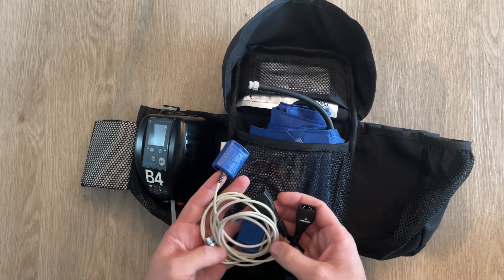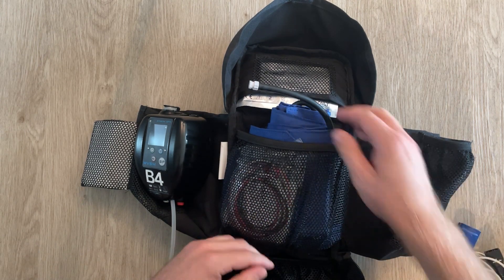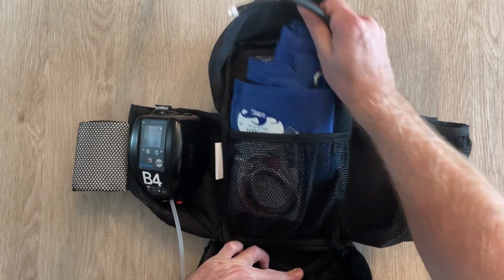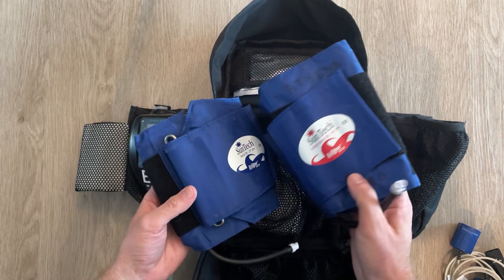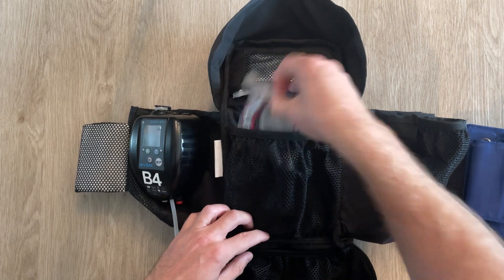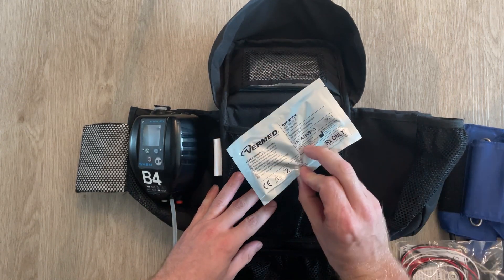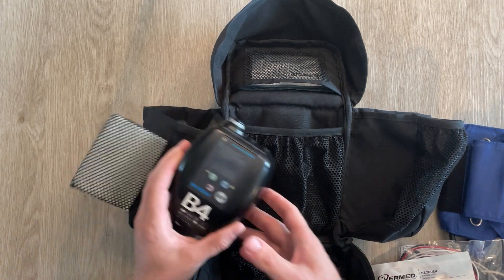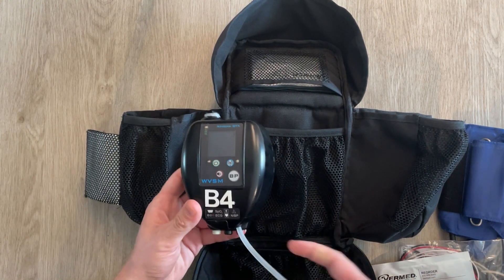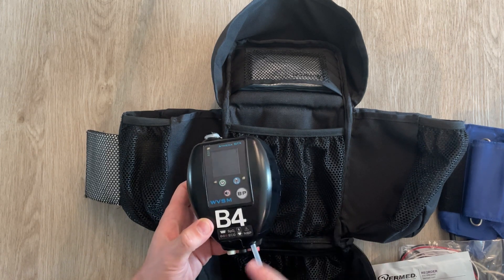It's got pulse ox attachments here — a couple of them — a couple of BP cuffs, a regular and a large adult, cardiac monitoring leads, and some cardiac monitoring stickers. So this is really the full package for patient monitoring — everything short of end-tidal CO2 monitoring, this thing will do.